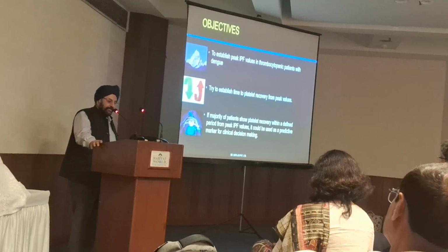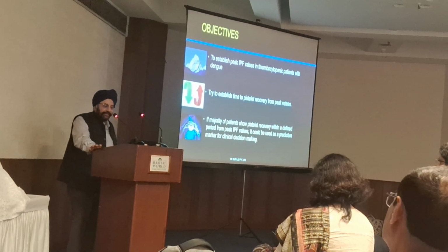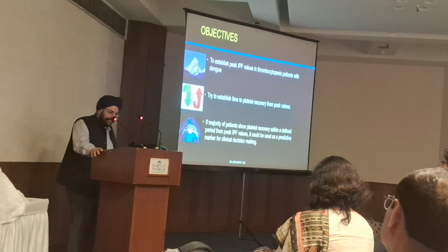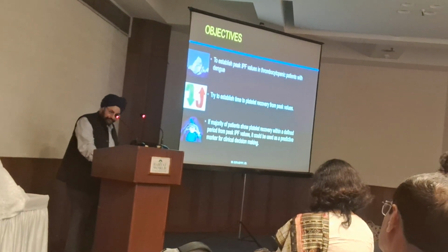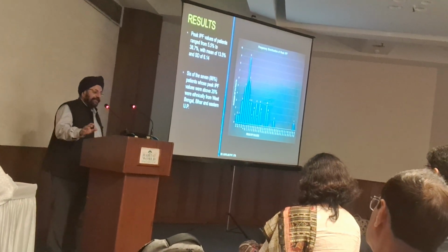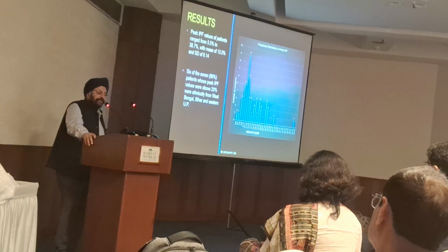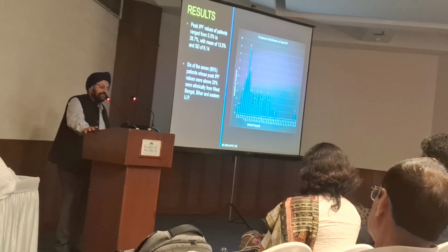So the basic hypothesis was, if the majority of patients show platelet recovery within say 48-72 hours, it could be used as a predictive marker for clinical decision making. These are our results. The peak IPF values of patients range from 5.5 to 38.7% with a mean of 13.5 and a standard deviation of 6.14.